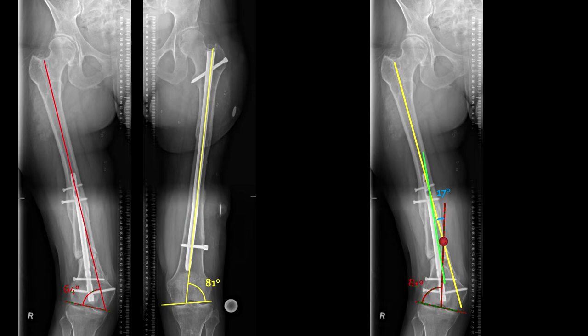But actually, at that point, we noted she's got a pre-existing deformity at a slightly more proximal level from her original injury. And so I think deformity is probably better characterized by a third line. And you should hopefully be familiar with those things from what we've done. So we think that probably is a reasonable estimation of the deformity for this patient, yeah? Everybody happy with that? Yeah, so we've done that lots of times already, haven't we, this week?